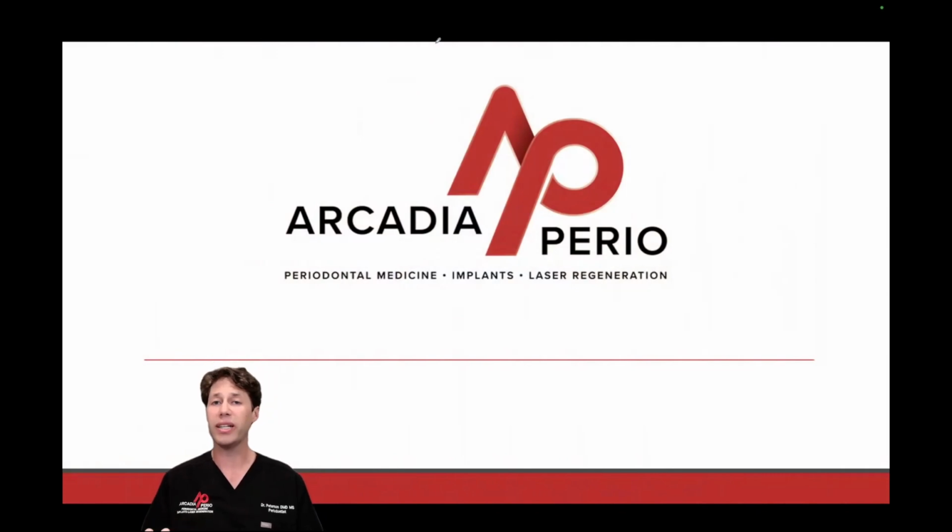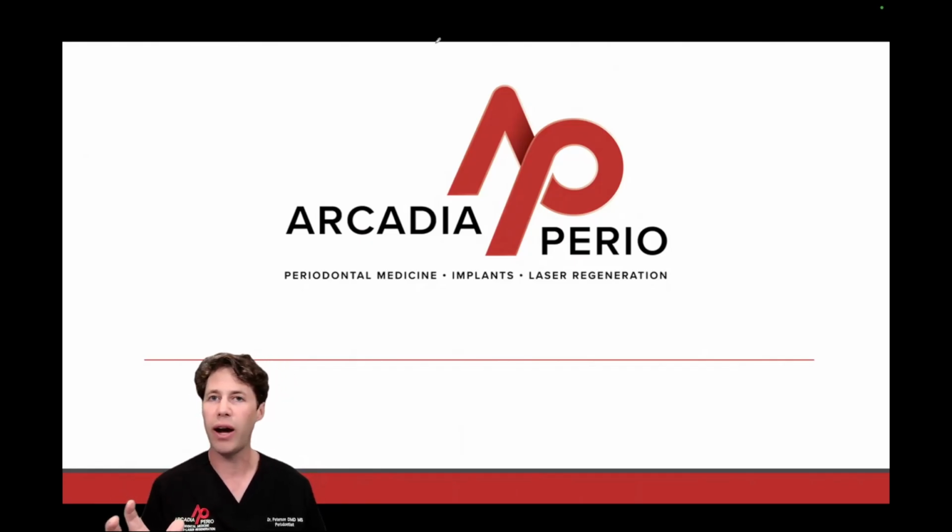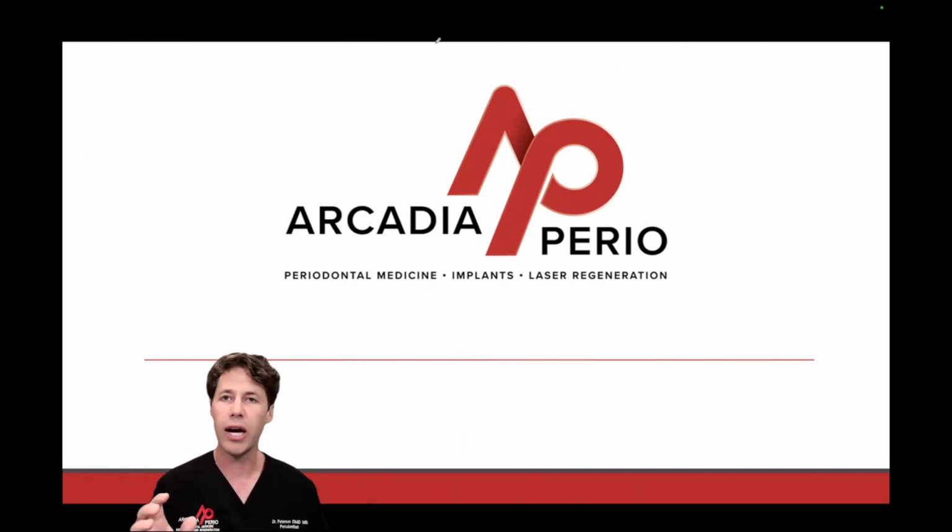So I hope you've enjoyed this case. Today's case was a little bit shorter of a case, but we'll talk a lot more about immediate implants and tips and tricks along the way to get good primary stability, when to choose a cover screw versus a healing abutment, when are you going to do soft tissue grafting, what type of bone to use, when are we going to use a membrane or not. All of these questions will continue to be answered as you start to see more clinical cases.